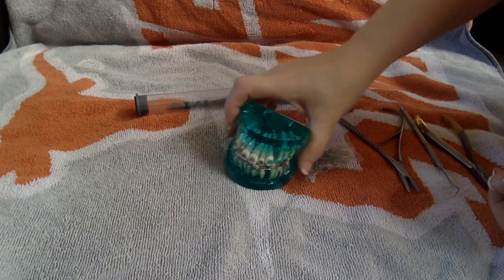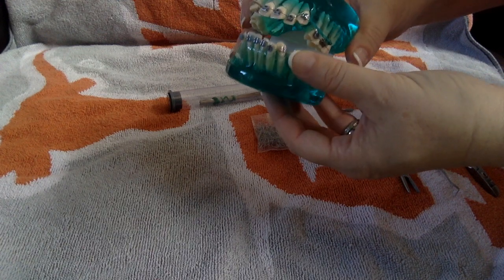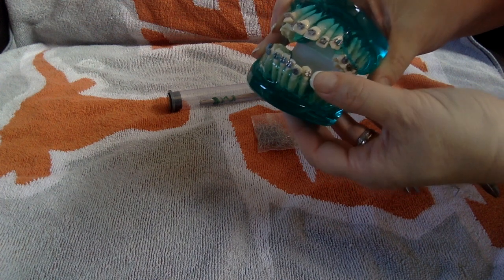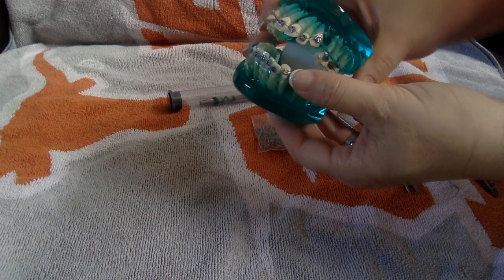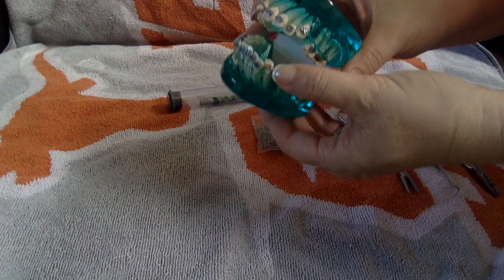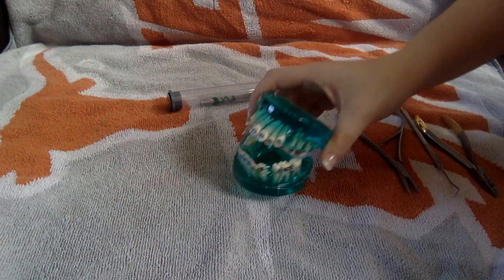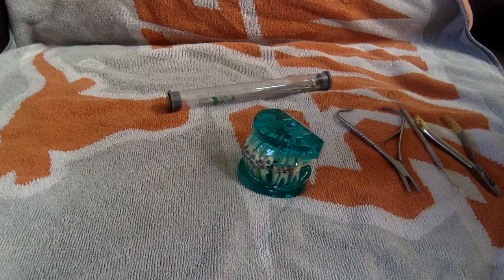These have a variety of different functions, but what we're going to talk about today is how to engage a tooth — let's say you just bonded and you have a tooth that's a little deflected and a wire is tricky to hold in fully and securely with an elastomeric tie, or maybe the patient's going away for a couple months and you don't want gross elastomeric ties on and you want it to be more secure. That's why I'd use a stainless steel tie. Synonyms include quick tie, steel tie, stainless steel tie, SST, or SSQT.